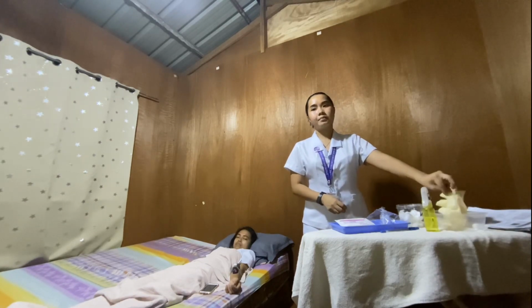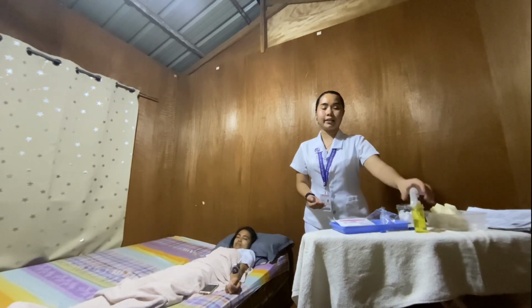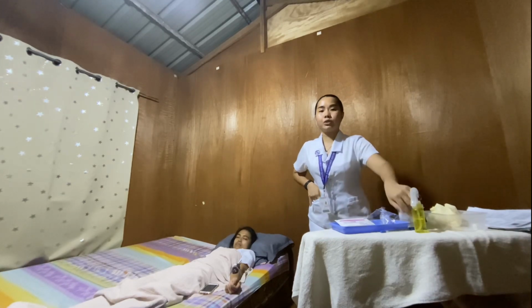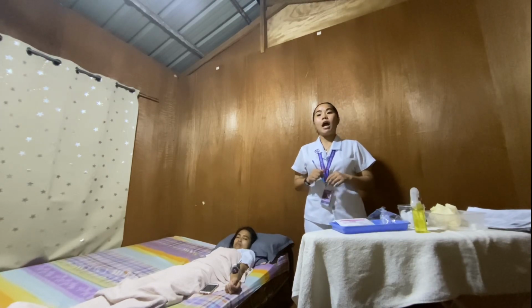And then perform hand hygiene. This is to protect our client and ourselves from any spread of pathogenic microorganisms. Next is, with the help of the blue ball pen, circle the insertion site with ink to observe for redness or induration.